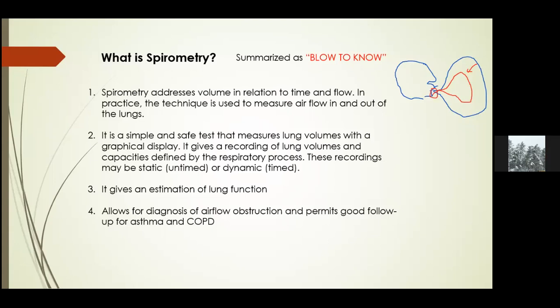So when you blow in and out, it means that the volume of air will be fluctuating between this volume and that volume, and this will be the tidal volume. So as you inhale, exhale, that volume is what you'll be calling a normal, slow, or tidal volume. Then if you are to blow it further, say for example, use more force, it means the balloon will become larger. And if you are to make sure that you inhale as much air as you can, it means that the air outside here will be small. The balloon will be small.